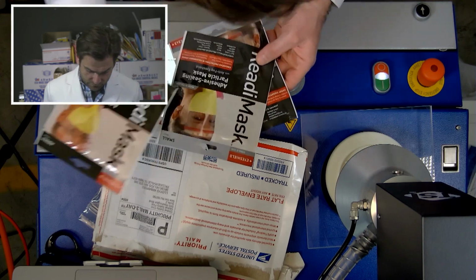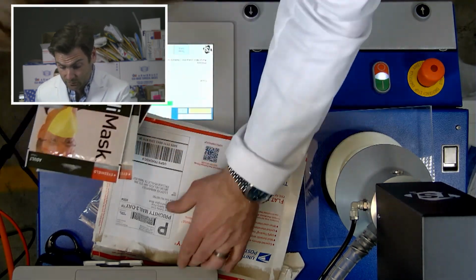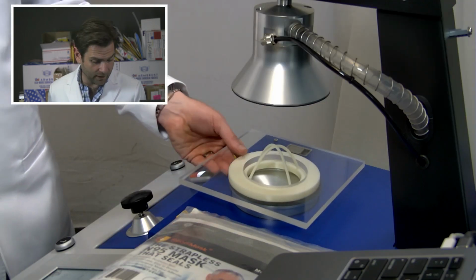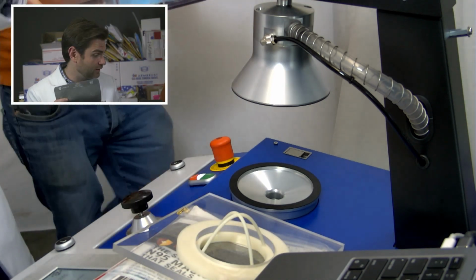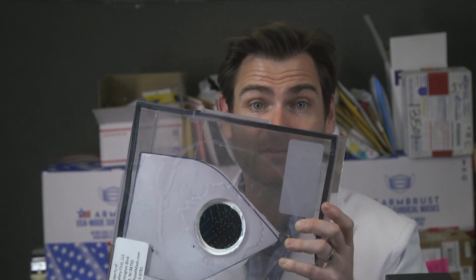And he's got all these different versions, and it's crazy. It's flat folded, and it goes on your face. I can't just use my normal apparatus or the one we were using before because it won't appropriately test this. This is an N95, an actual NIOSH N95. The CEO of this company sent me their testing apparatus a week after we moved our lab. It's been a while since I've had this, so John, I'm sorry from the bottom of my heart. But we're testing it now.